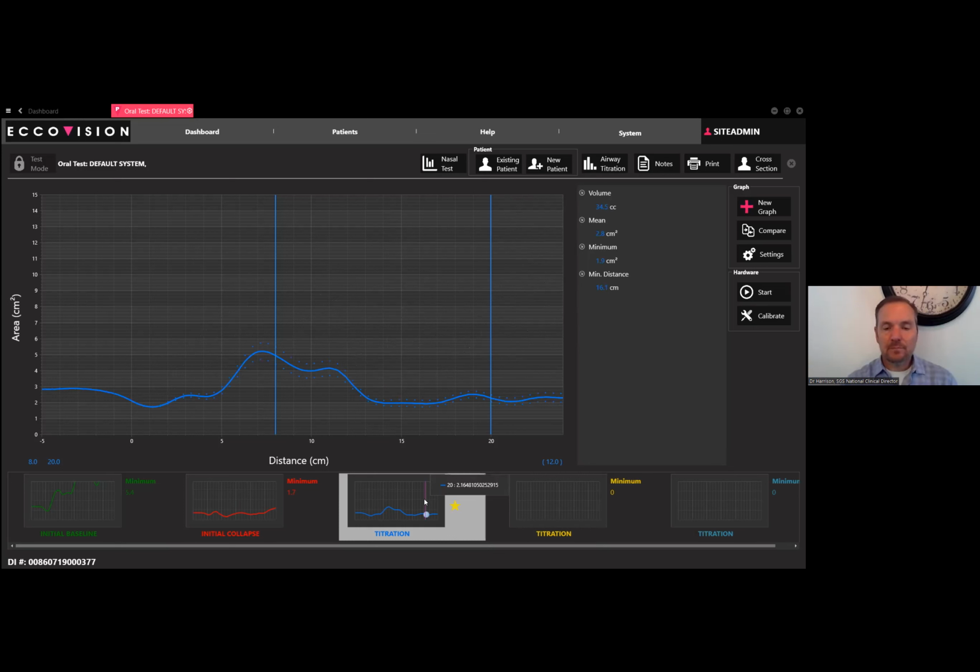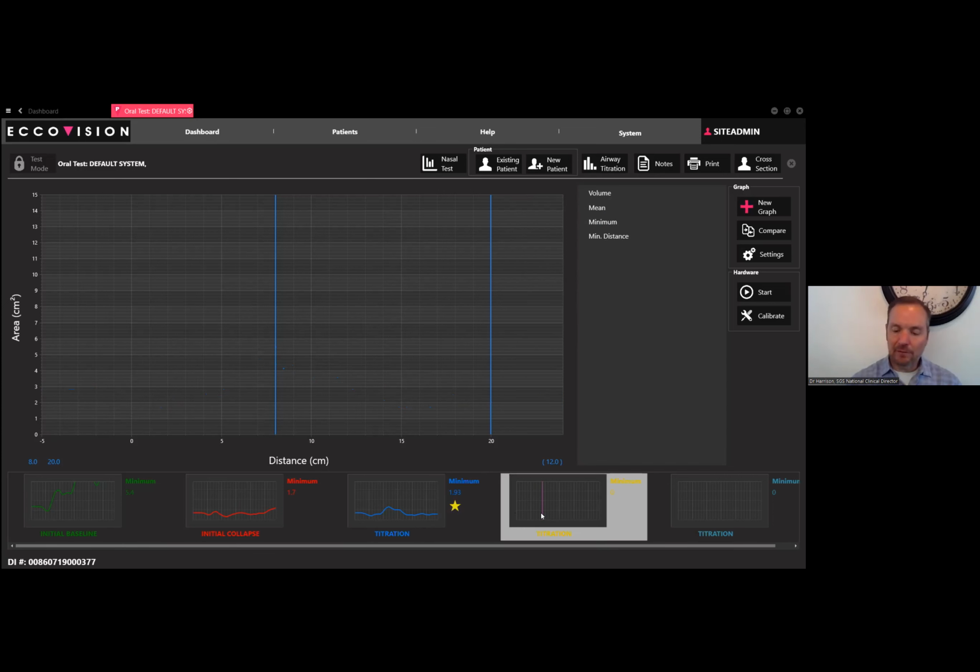Okay. It gave me a star there because that was the best one we've done so far, which was the only one. Now I'm going to go to 8. Okay. And this is still end to end.